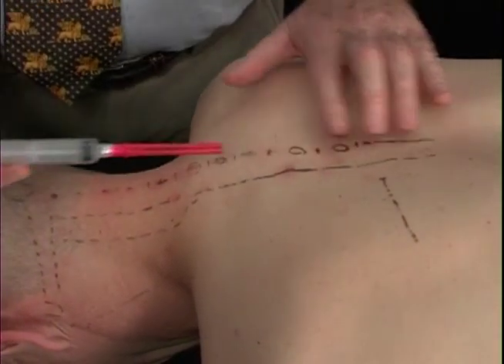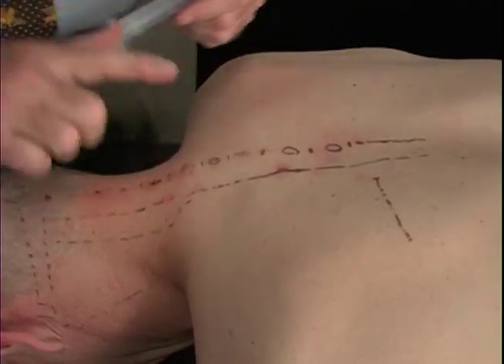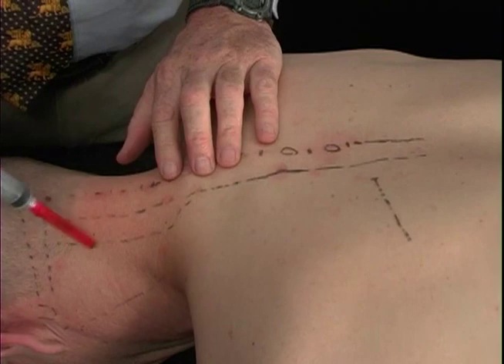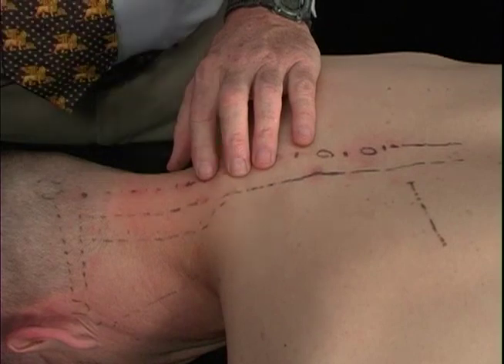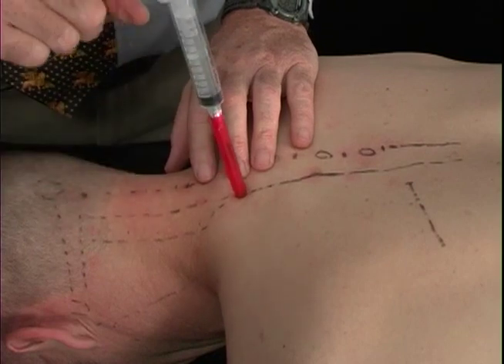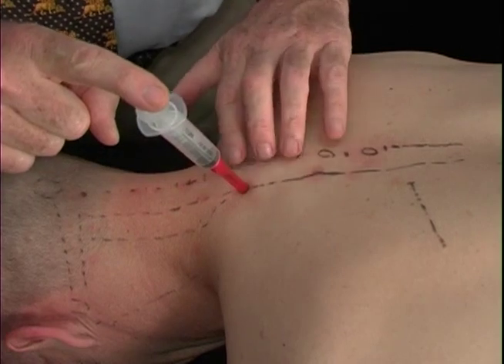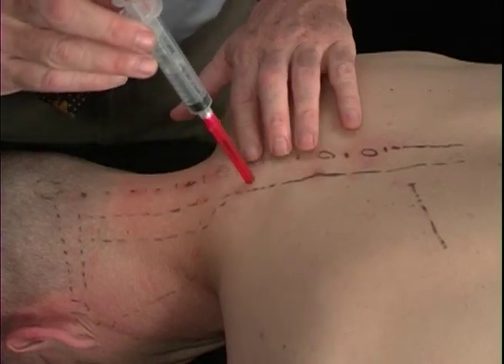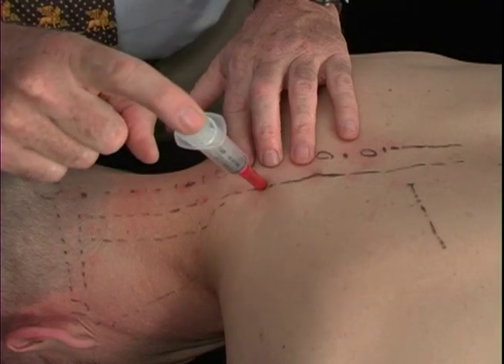Our next injections then are onto the facets. The facets in the thoracic area move medially so that they're 1 finger breadth off the spinous processes, and they move quite a bit deeper than they are in the cervical area. So our angle of injection is with the syringe straight down and then angled medially toward the spine. So this is perpendicular, so we're angling the needle medially toward the spine, keeping our fingers on the spinous processes here so that we don't drift off into the lung, and keeping our needle again aimed from perpendicular medially.